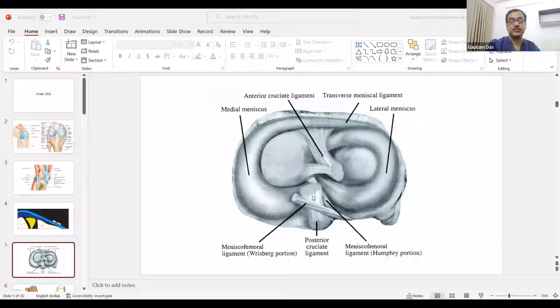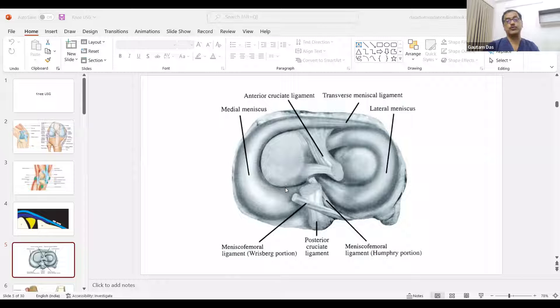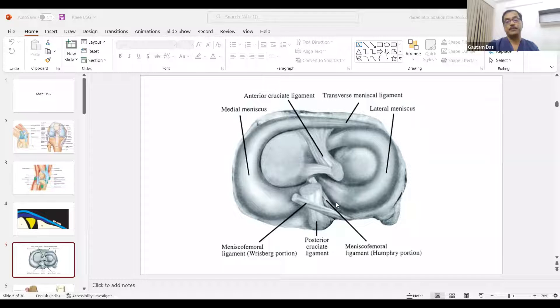The posterior cruciate ligament is best identified via the meniscofemoral ligament. The meniscofemoral ligament starts from the lateral part and goes to the medial part of the femoral condyle, enclosing the posterior cruciate ligament. There are two portions of the meniscofemoral ligament — anterior and posterior — which enclose the posterior cruciate ligament.